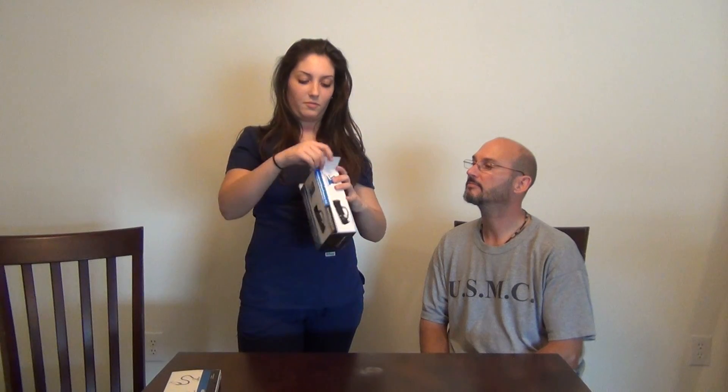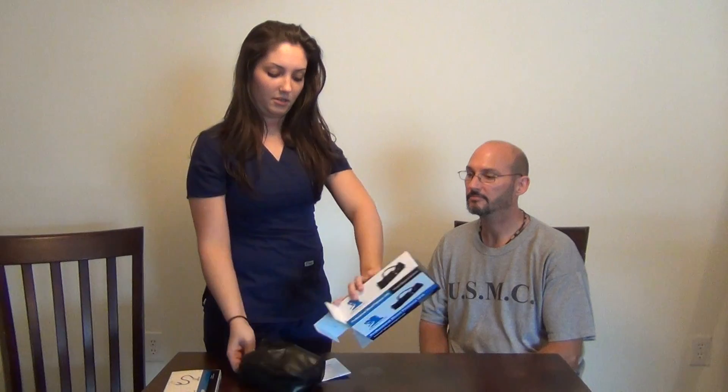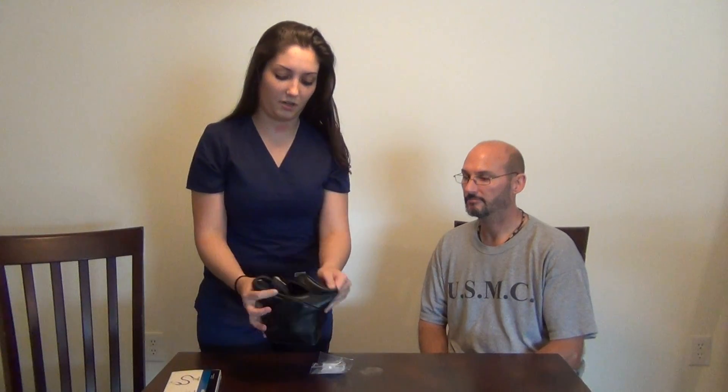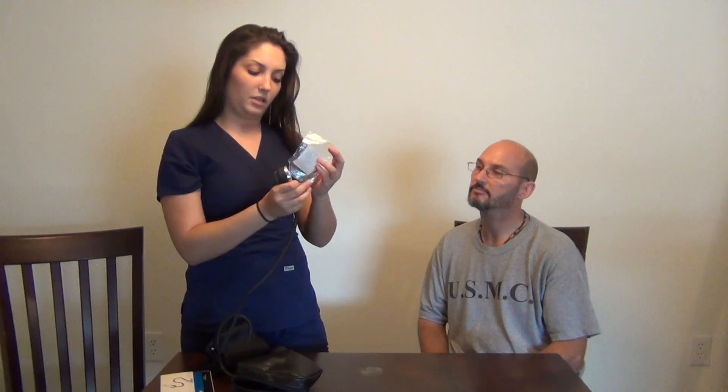Go ahead and open up the blood pressure cuff box. You'll find three things once you open this up: directions with step-by-step instructions on how to use it, which you can use to go along with this video or come back to; a bag that has the blood pressure cuff in it, all hooked up and ready to go; and a little key that is used to adjust the meter if it's not already at zero. You can use the directions to adjust it if need be.